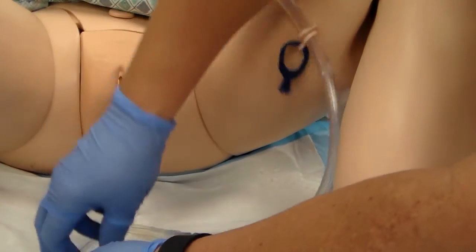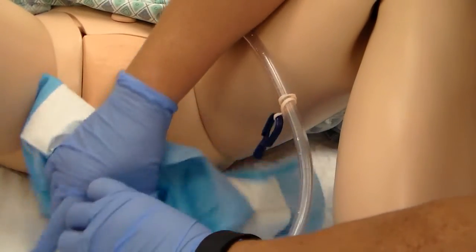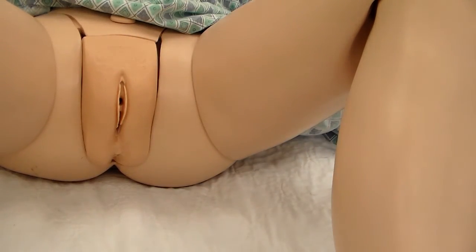All right, so what I want to do now is I'm going to wrap this Foley catheter up inside the chucks, okay? And I could take this chucks and the Foley catheter, see, everything all in one fell swoop to the garbage, okay? So this all would go in the garbage, okay?